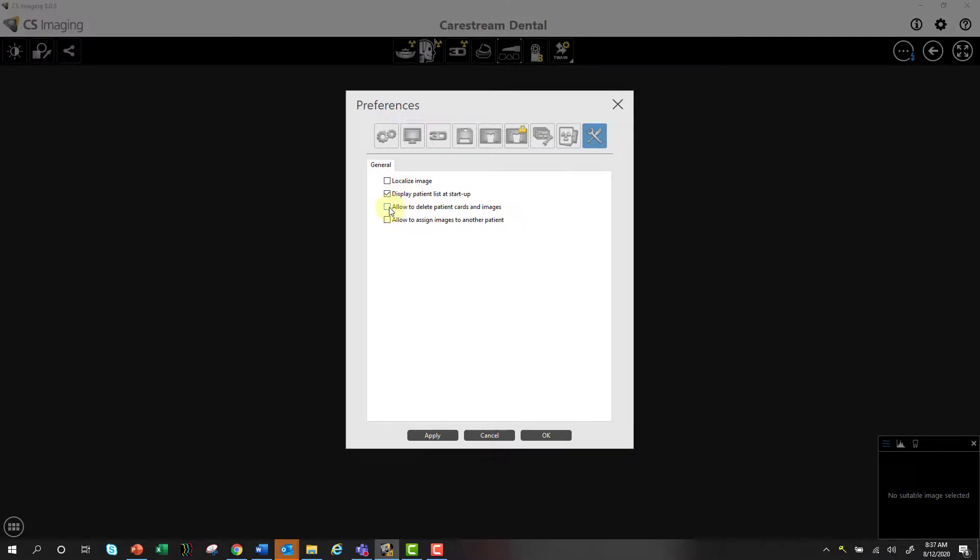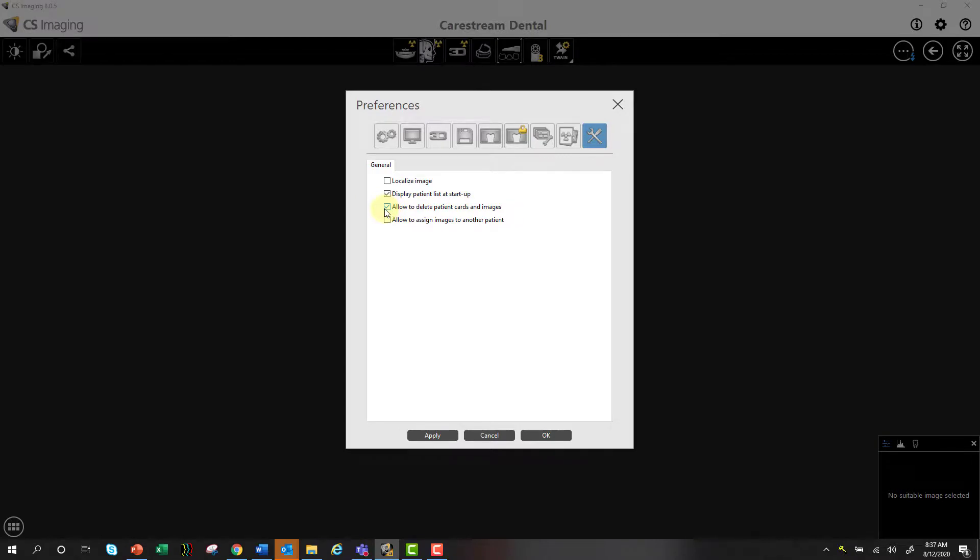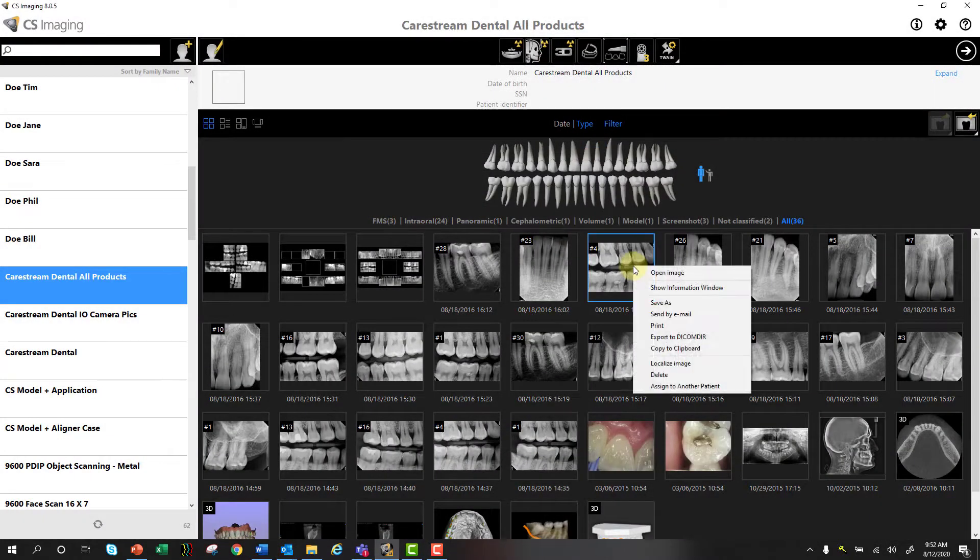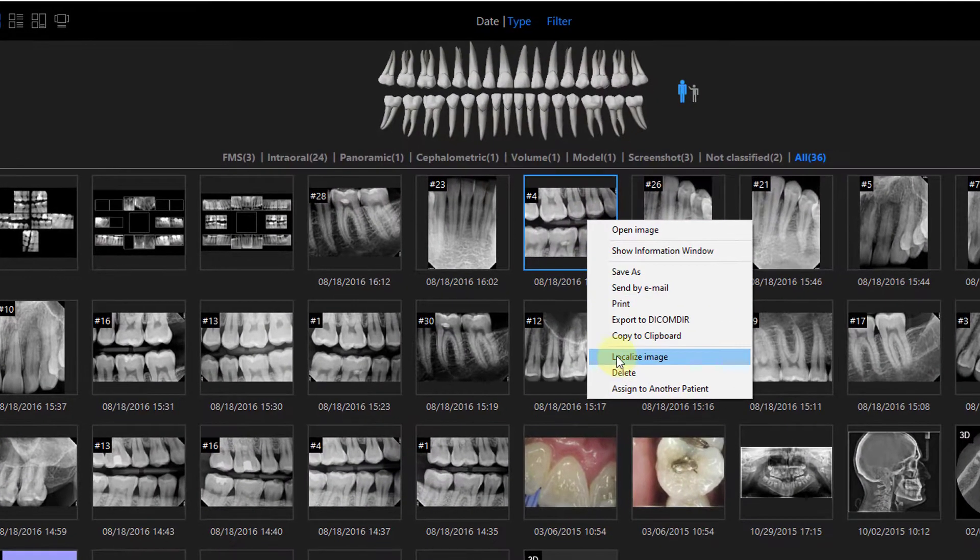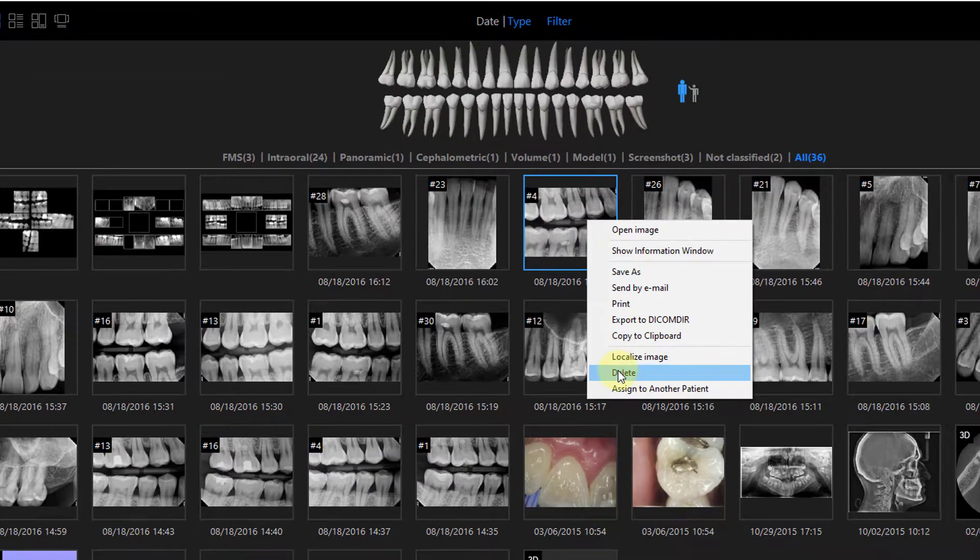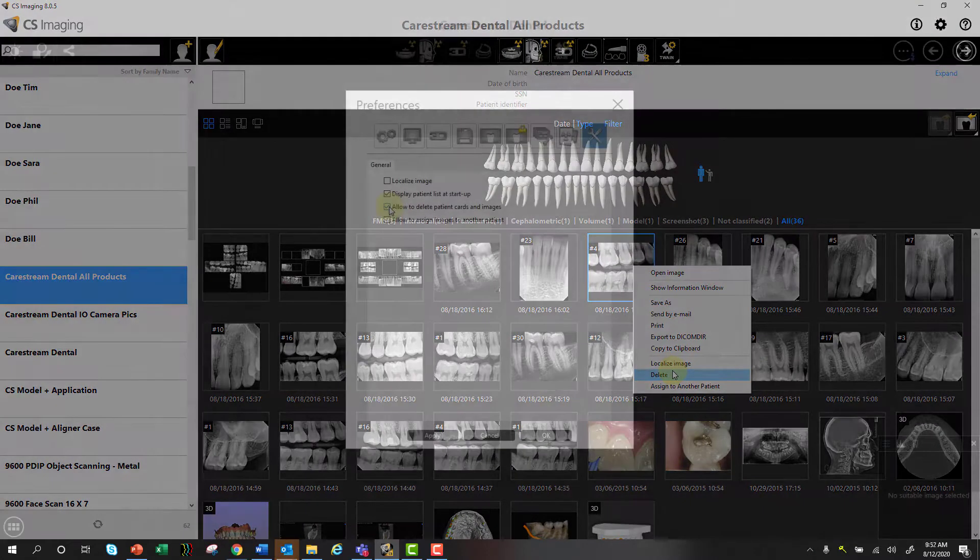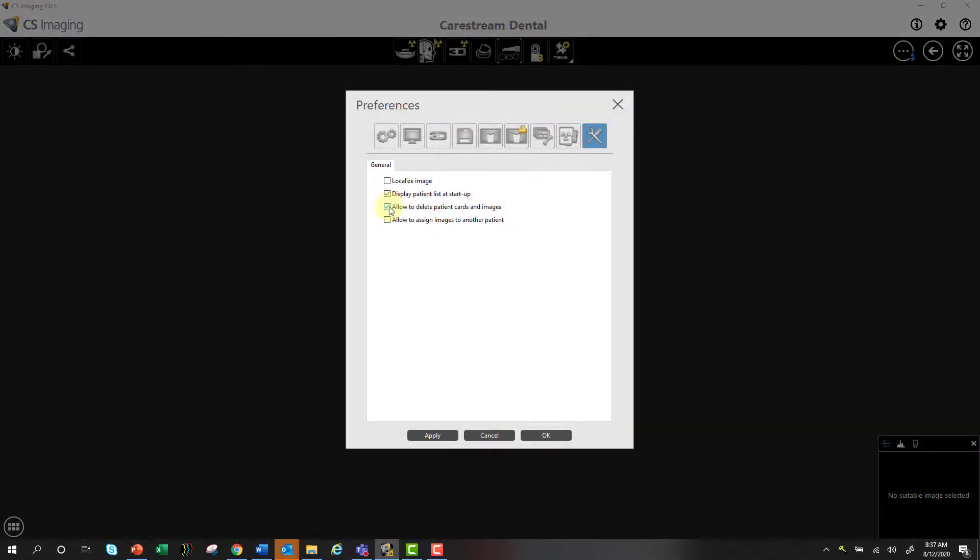So if I don't select this option, then you'll never be able to delete images. So you might want to restrict that on some of your workstations with some of your team members. That's really up to you and what you want to do and how you want to do it. But by checking this box, you'll be able to right-click on an image and then delete it.